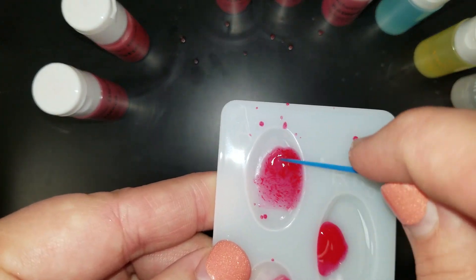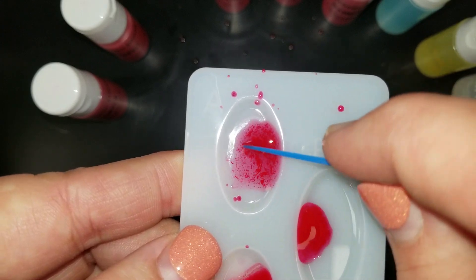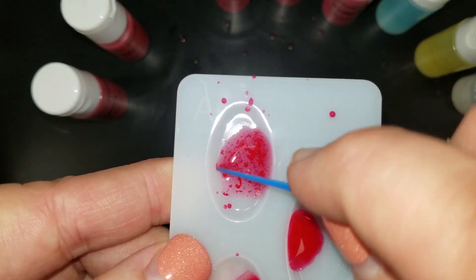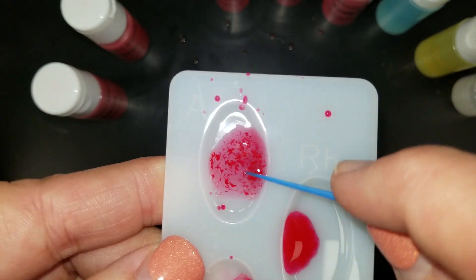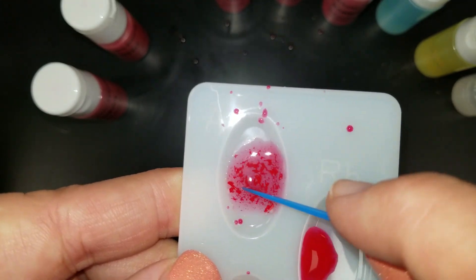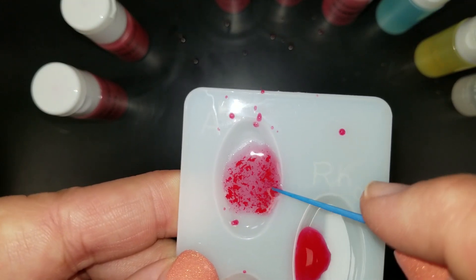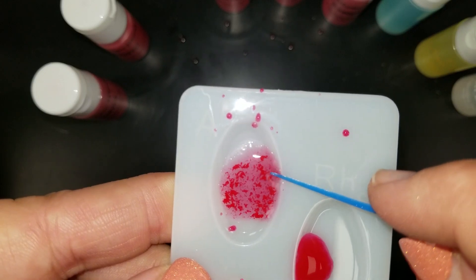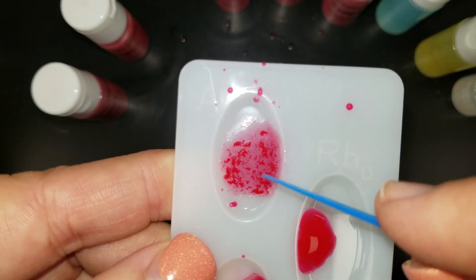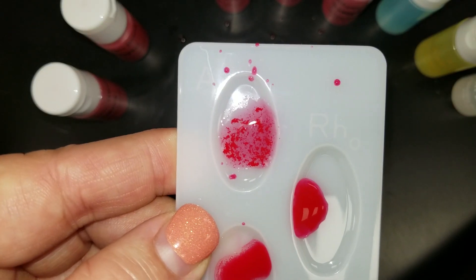And you're just going to mix those together, and you can see how we're getting separation. We're getting little red clumps in that serum. That's a positive reaction, which means that Andrea has the A antigen. This is a positive because they've mixed together.